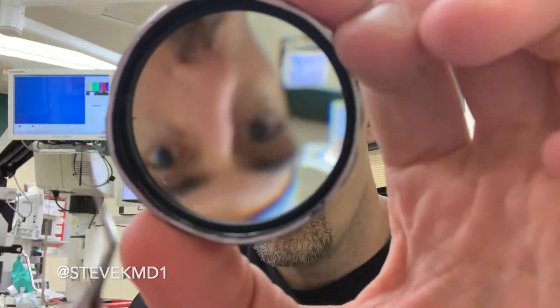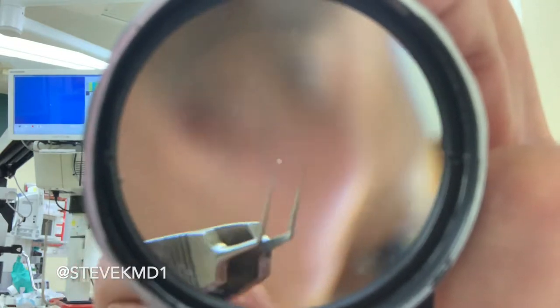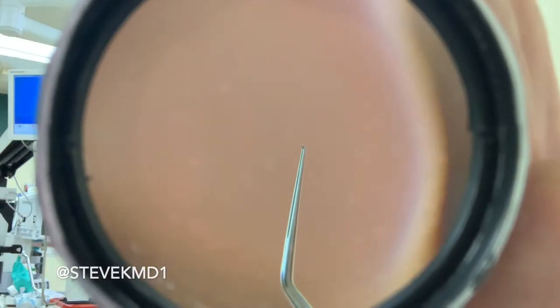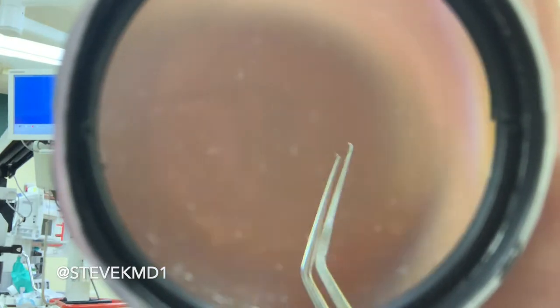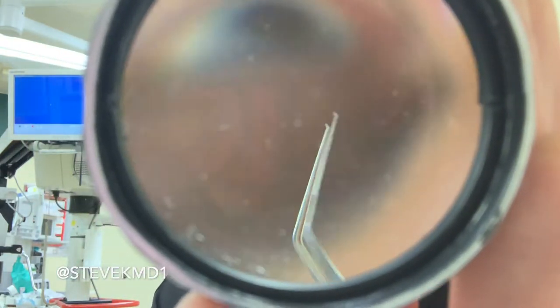Once we do that, the very next instrument we use is called the Utrata. It looks like tweezers, but when you zoom in, it's got two pointy ends on it. The reason for the pointy ends is that this has to grasp the capsule as we do our capsulorexis. So it looks like a tweezer with pointy ends, and we use it to do our capsulorexis.